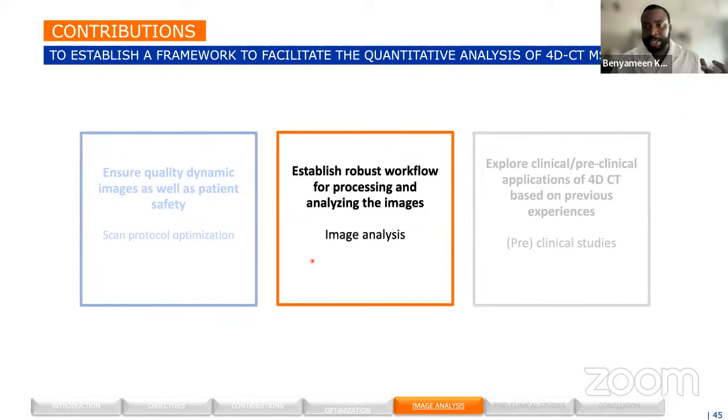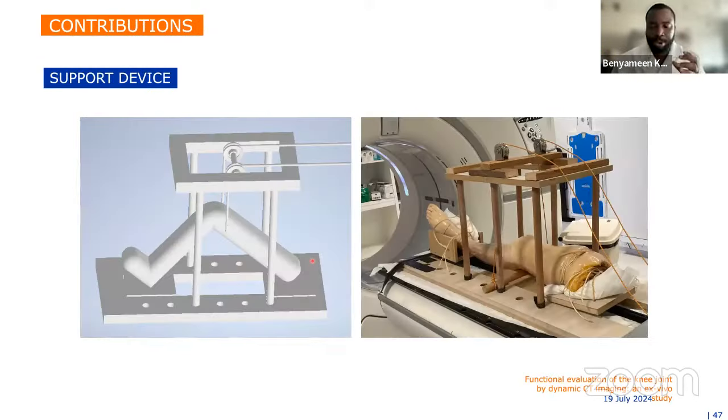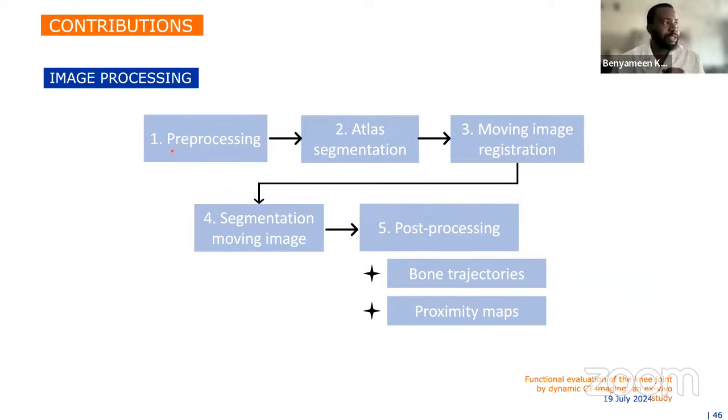So with that said, it leads us to the next block, which was aimed at developing a process that can, one, automatically do some of these things, but also allow us to do these type of computations in a much more relevant and representative way. So here is a bit of the workflow we went through. I would not spend so much time on it. So there's a bit of pre-processing. We developed an automated way of segmenting the structures based on what is known as atlas segmentation. And this basically allowed us to now feed the result of our automatic segmentation into our registration workflow.